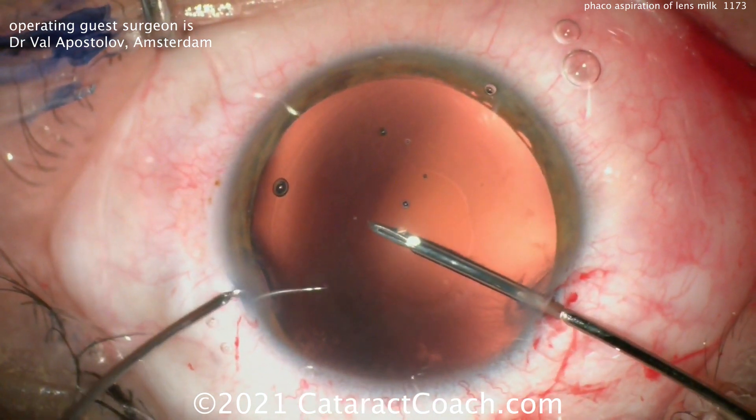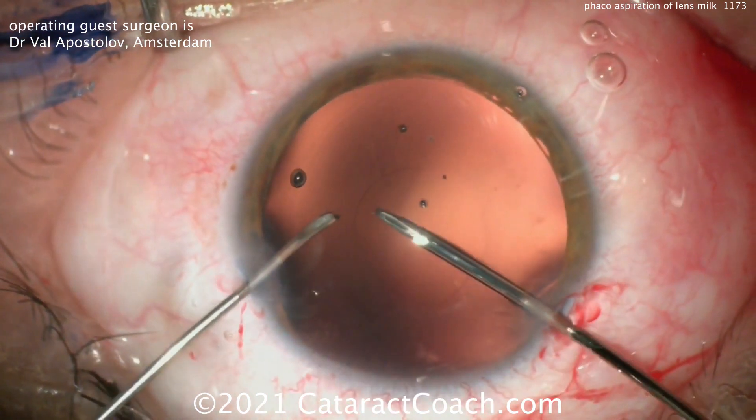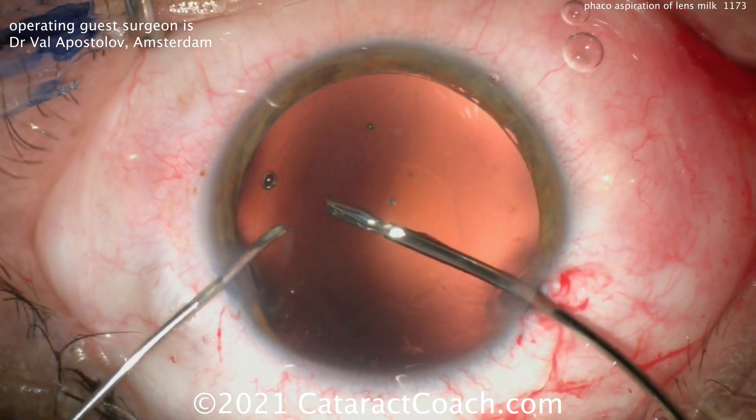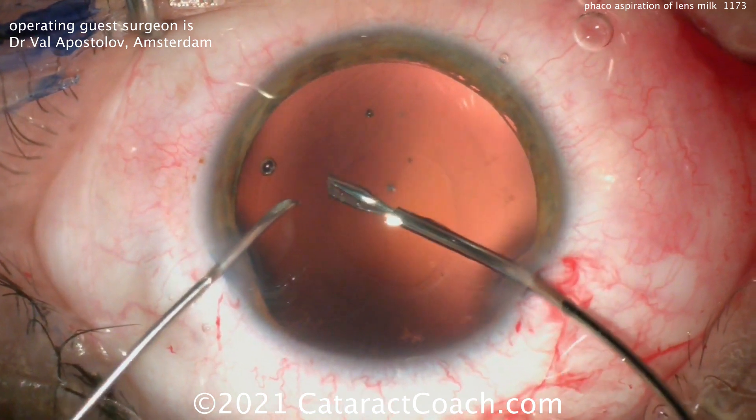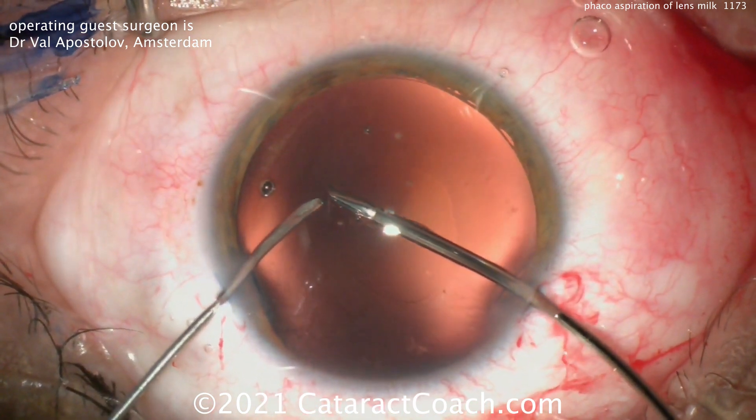Now with the eye full of viscoelastic, going to enlarge the rexis. The rim is being held first with those micro forceps, and it looks like an instrument is going to be used to nick the capsule and start the tear — there it is — and now the tear can be continued.